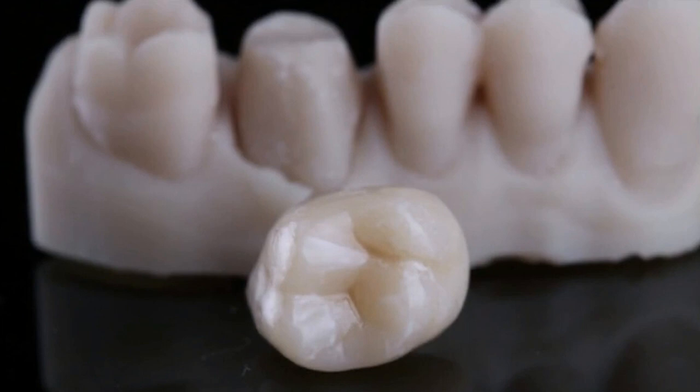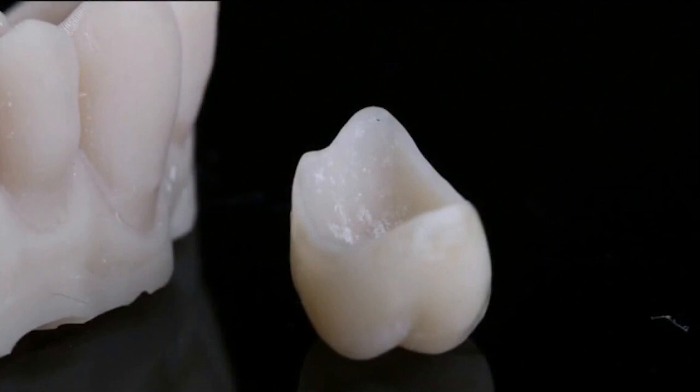That's a different view of the crown. I believe it looks gorgeous, looks beautiful. And look at those margins, those margins are incredible. The integrity of those margins, and they don't break. These composite crowns don't break, because they're going to be bonded into the tooth, okay? They will stay there. Very important, I'll be touching base on how to bond this. At the end, I'm going to explain how to bond these materials, okay?